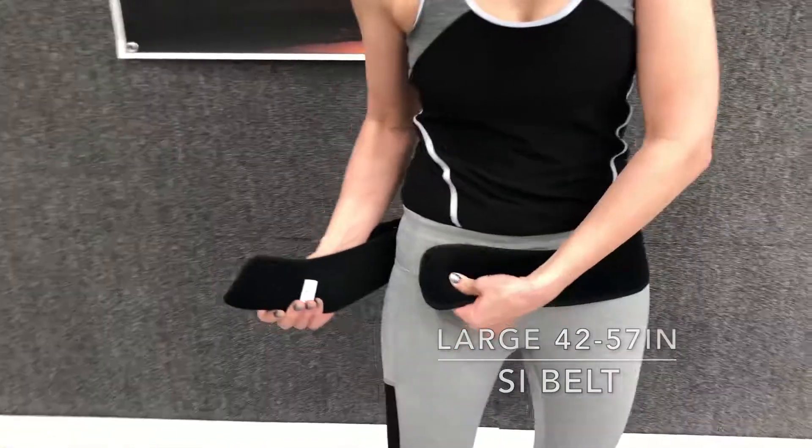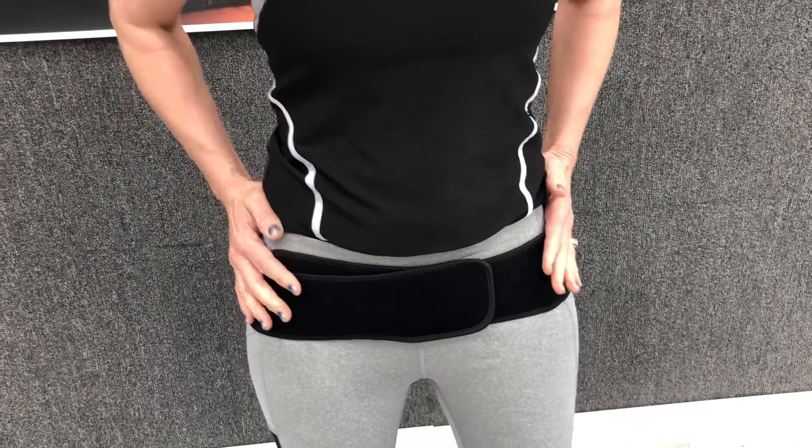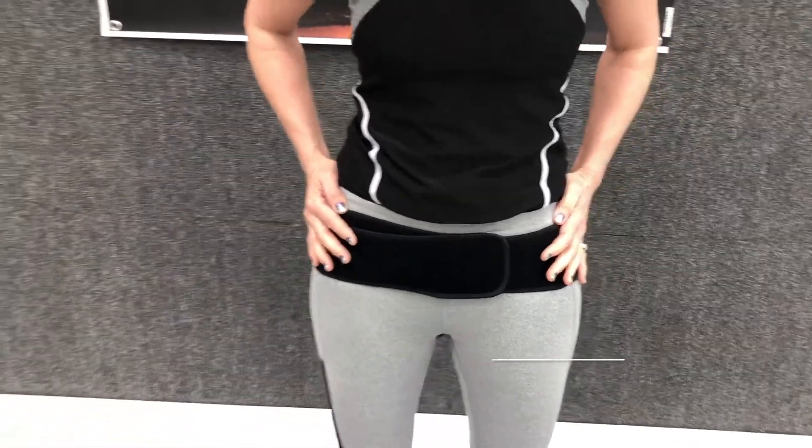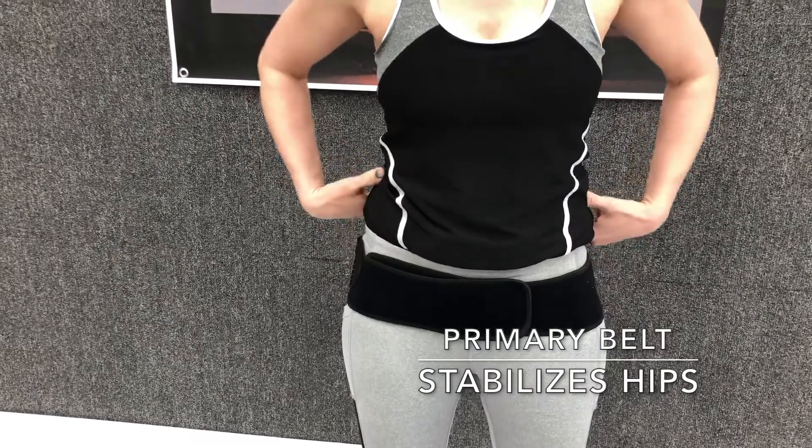You place this around your hips, just like this. This is the primary belt, and it stabilizes your hips and your pelvis area so that you can reduce movement that can cause inflammation of those nerves.